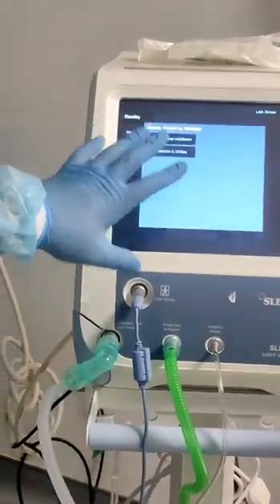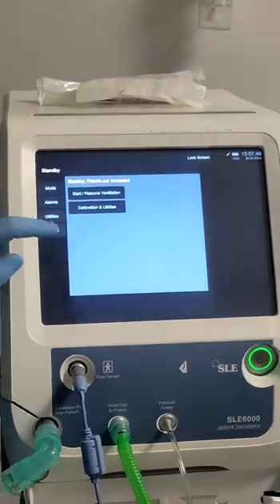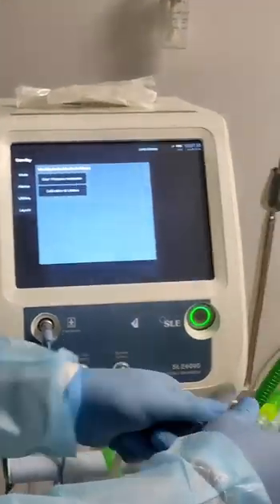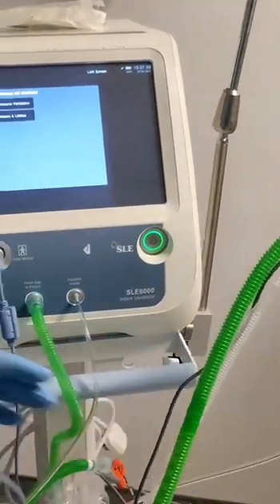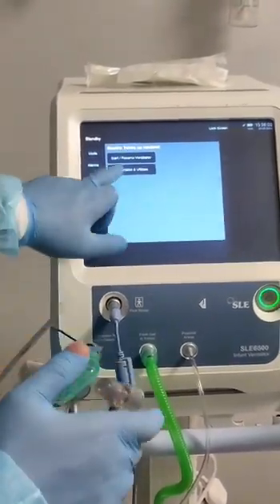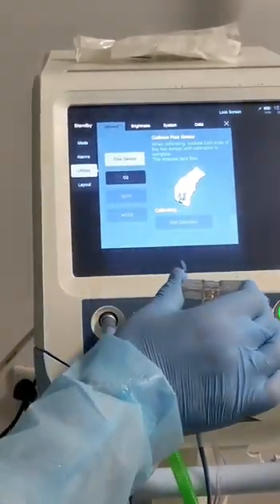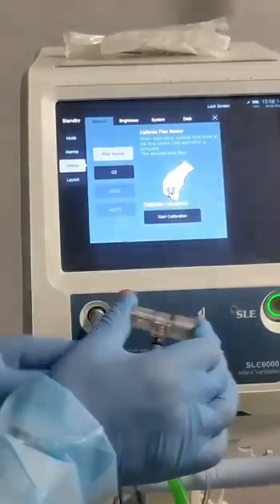When we switch on, this screen will appear. First, it will ask for the flow sensor calibration — it's easy. Just disconnect the flow sensor, and in case the machine is on, it can still work. Do the calibration for the flow sensor — press the calibration button, flow sensor calibration. Just close it and now the calibration is complete.